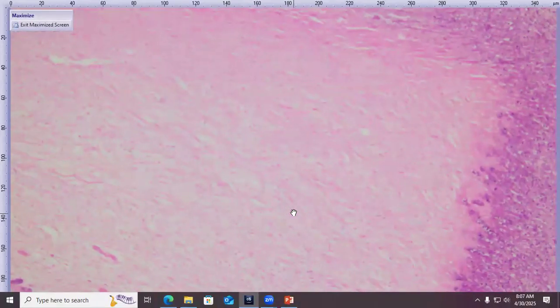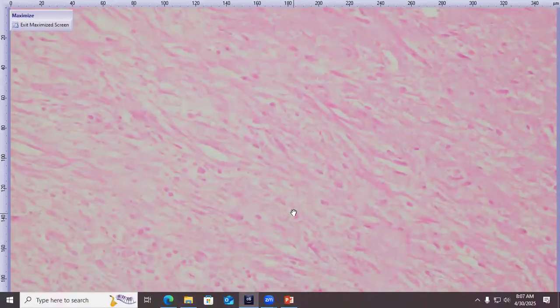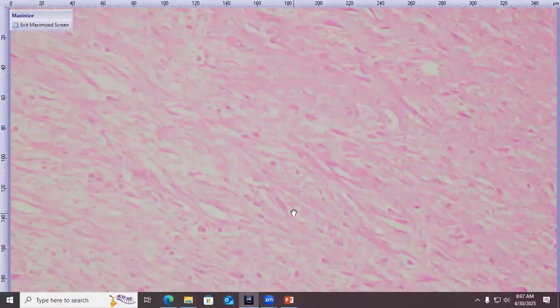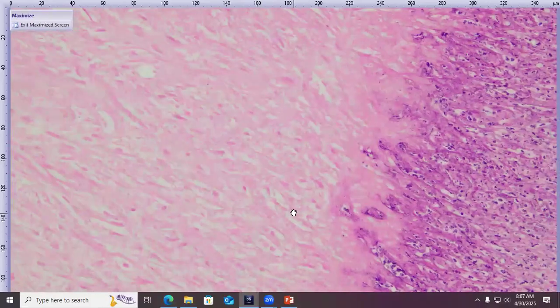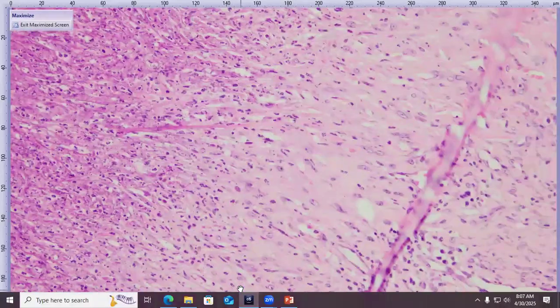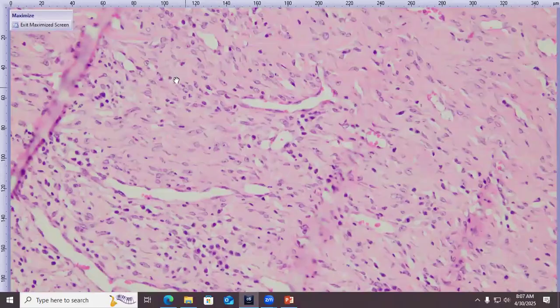So we have these areas where we can see some normal cellular and stromal architecture, but it's hypereosinophilic. We can't really see nuclei anymore. There's kind of just the loss of the normal staining. So this is consistent with coagulative necrosis. And kind of at the periphery of that, we just have this zone of neutrophils hanging out. And then if we go into the more viable regions, it's just composed of kind of fibroplasia and granulation tissue.